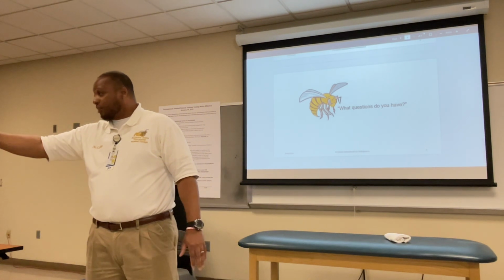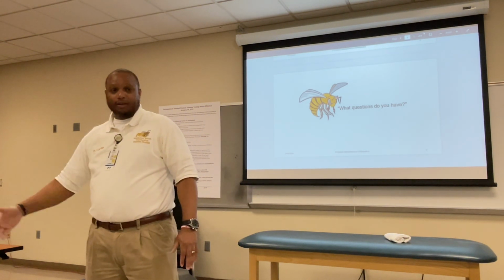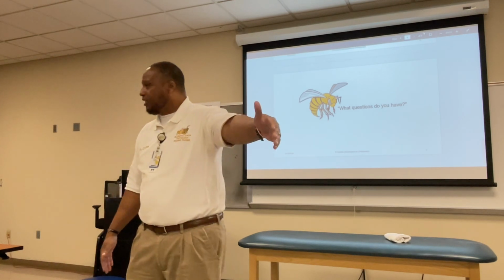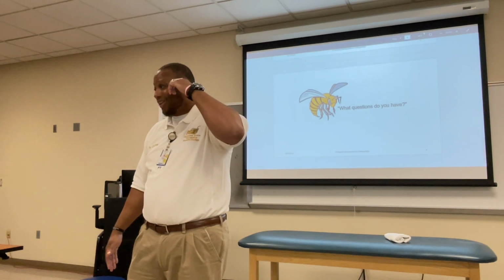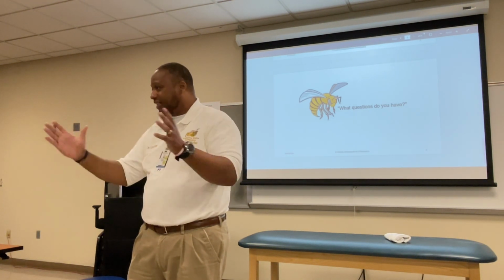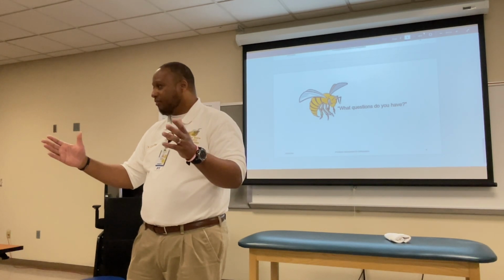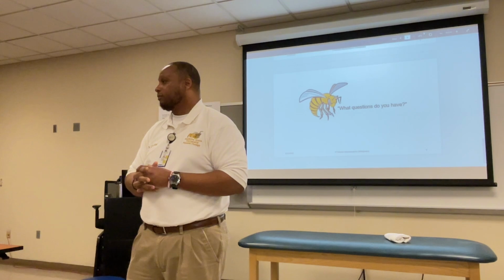So Liz gets only 0 to 80, you get 0 to 90, Taylor you come back, get 0 to 120, and then say a Cajun comes and gets 0 to 110, then there is no inter-rater reliability. Because y'all numbers are so vastly different that you can't say that there's inter-rater reliability. Does that make sense?